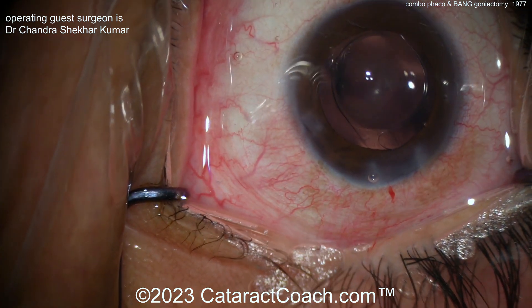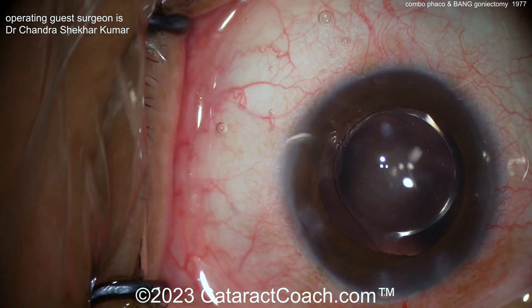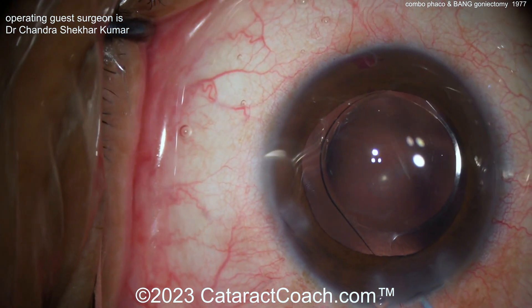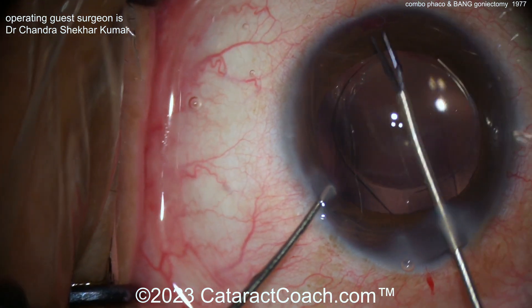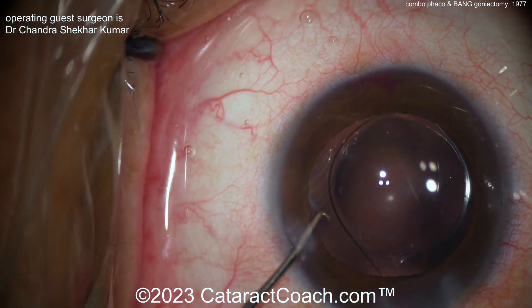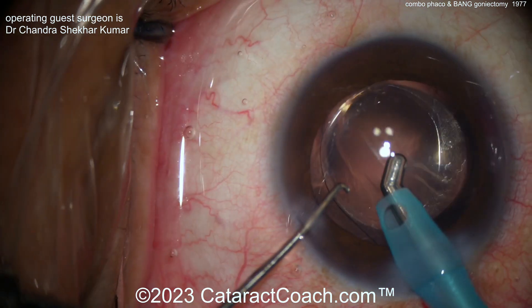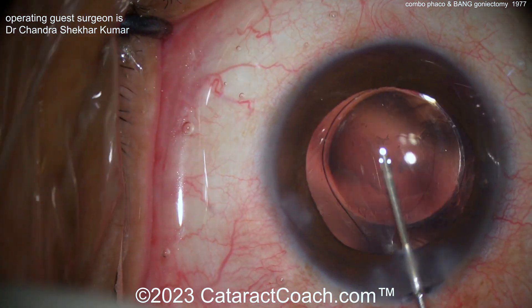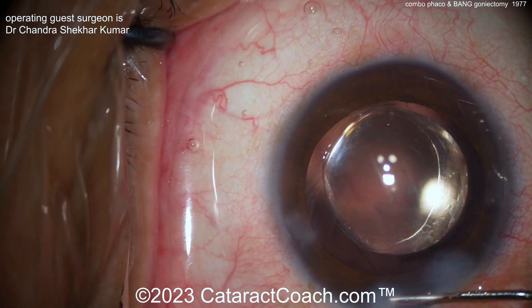At the end of the case — wow, it does look beautiful. If you don't know about the BANG technique — B-A-N-G, Bent Ab-internal Needle Goniectomy — go to CataractCoach.com, type in the word 'bang,' and the video will come up. You'll hear from Arsham Shabani himself about the great pearls for success. It's something easy to do, you can definitely learn it, and the advantage for both you and the patient is it's very low cost — no matter where you are on the planet, you can get this done for just a few cents.